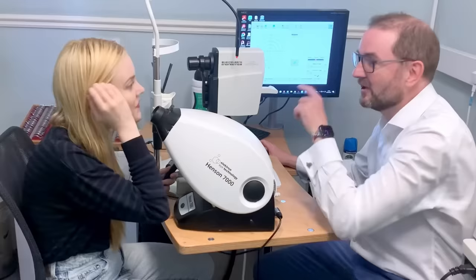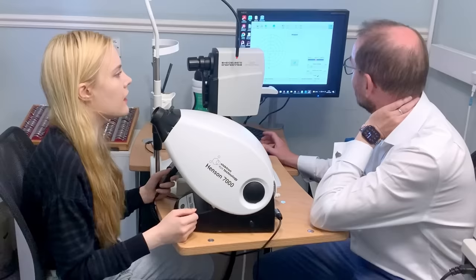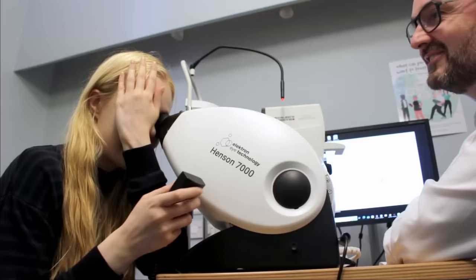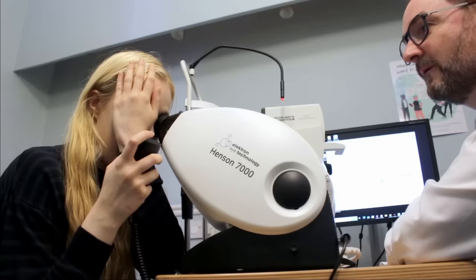We've got another test which does it in a lot more detail over here, but that's only if you have problems with your eyes. This one's a bit more straightforward. So if you go to the other eye, and then pop that in there. This is the left eye. I'll be slow with my left hand. Might be slower actually if I hold it in my left hand. I'll do this. Just reach round. Okay, you ready to go? Okay. There we go.